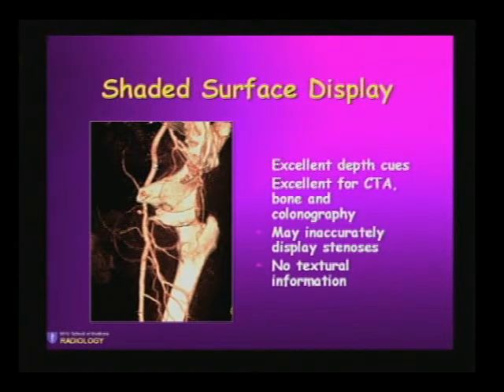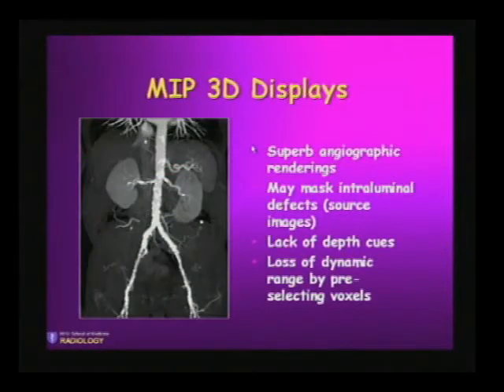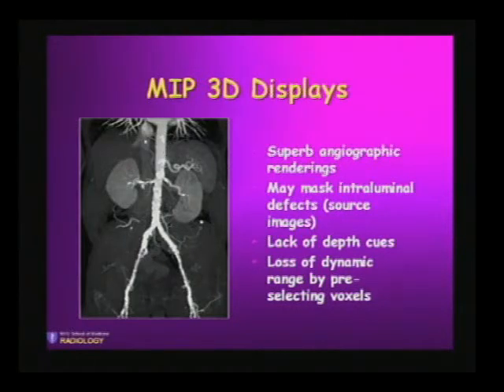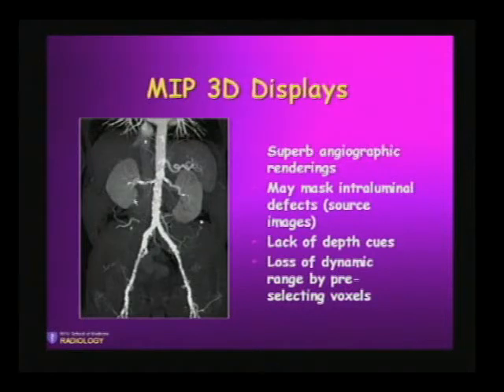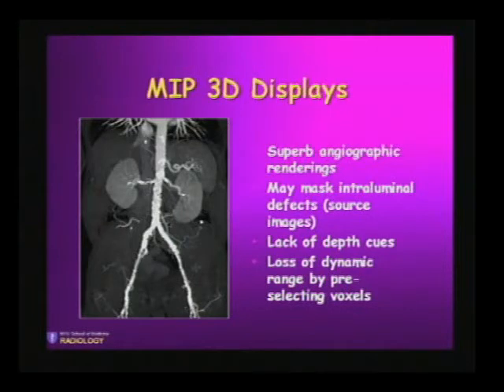One of our residents, Anuj Tolya, actually created this one night in a pelvic trauma case and was able to show a small pseudoaneurysm of the femoral artery while on call. The MIP 3D displays are great for looking at angiographic renderings — they project the brightest pixel along the ray of sight, and therefore they're great for vascular displays. They may mask intraluminal defects; Elliot showed you examples of how you can lose thrombi and stenoses within a MIP. They have no depth cues, so you get sort of an optical illusion — you don't really know where these vessels are in relation to the data set.